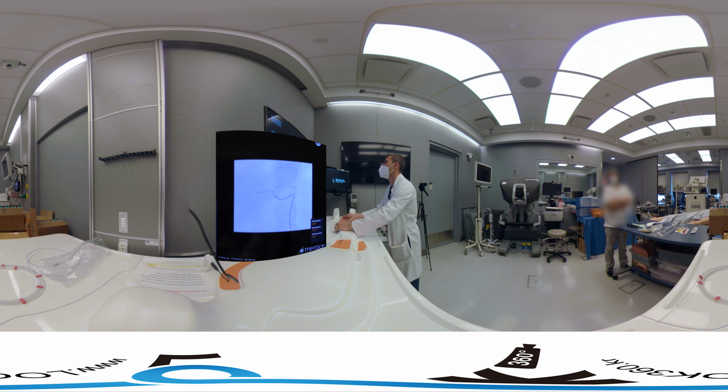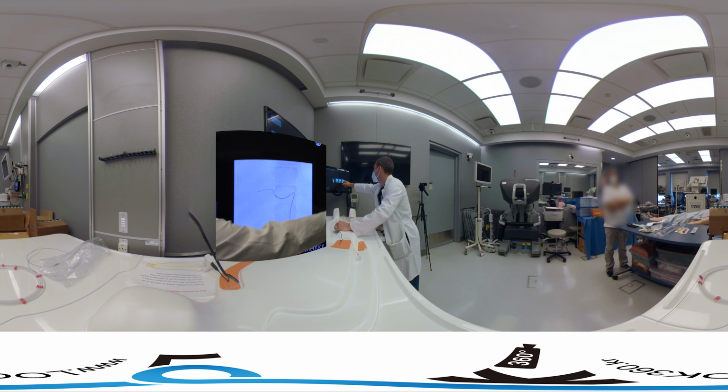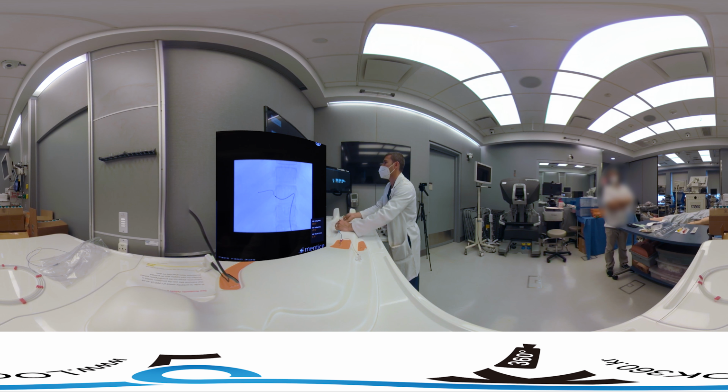And again, we'll come back just a little bit farther, pointing in a good direction. We'll use just a little bit more angle to get directly into this branch. So we'll do an injection, see how far off we are. So we're right before that takeoff for that branch that goes up to the tumor, right there.